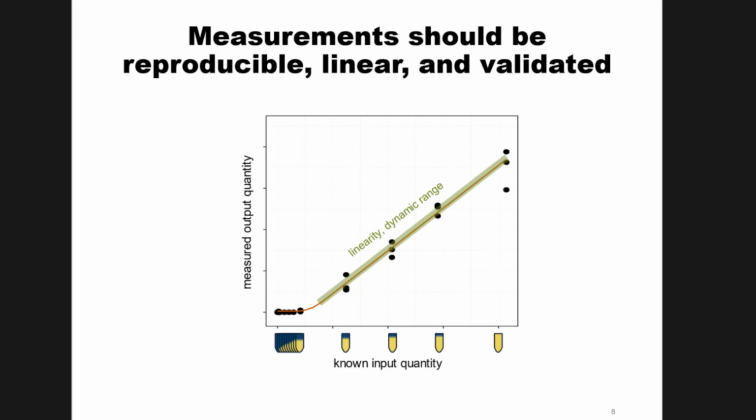The linear range, just to point out a couple more things like Andy was talking about: the percent coefficient of variation is, if I did one of these concentrations and analyzed it multiple times, how reproducible is the peak area I would get. There are a lot of different ways you can assess this, and we'll talk more about that in some of the later slides. But one way is to just leave that sample in your autosampler.